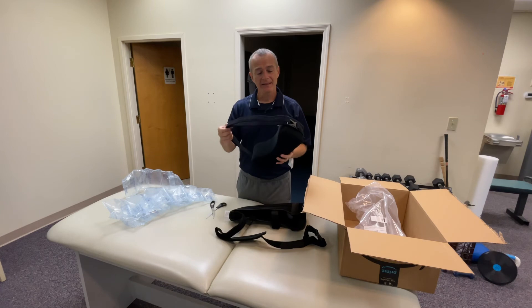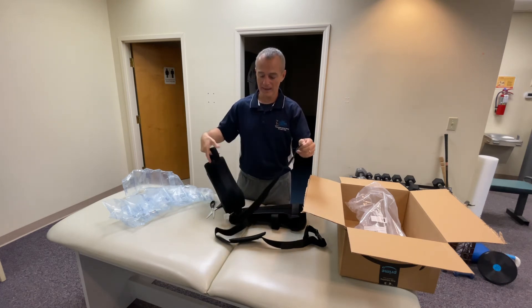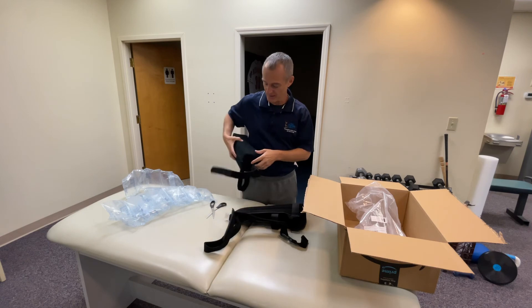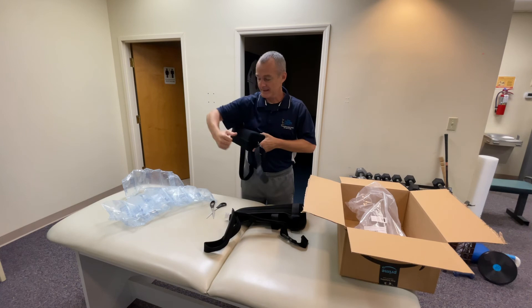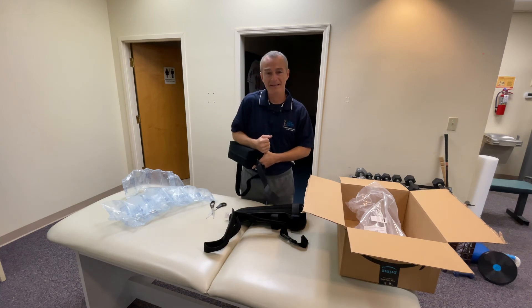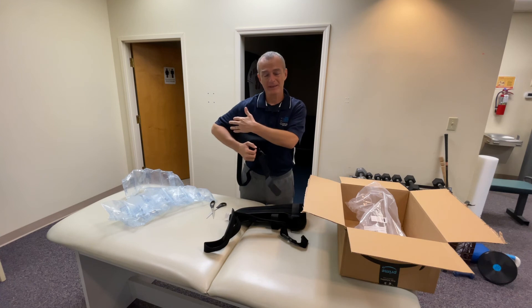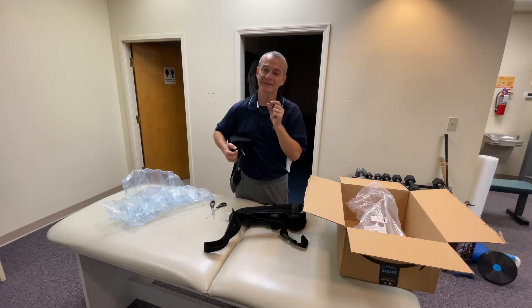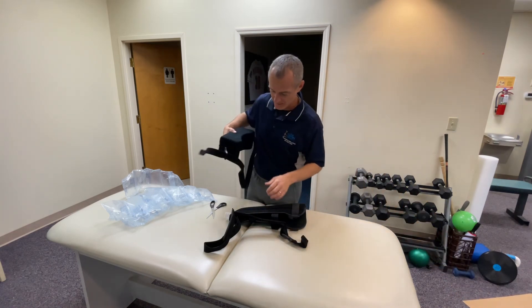The abduction pillow — a lot of times patients will use this incorrectly. There is a waist strap for the abduction pillow and you can see how it's curved on the inside. That's intended to come in from the side around the rib cage with the arm in the sling on top. Too often I see patients use it like a shelf and try to rest the arm on top — that's not the goal. The goal is to abduct the elbow away from the body to improve the circulation and positioning of the rotator cuff tendons to allow optimal healing. So let's put this on and see what we can do.